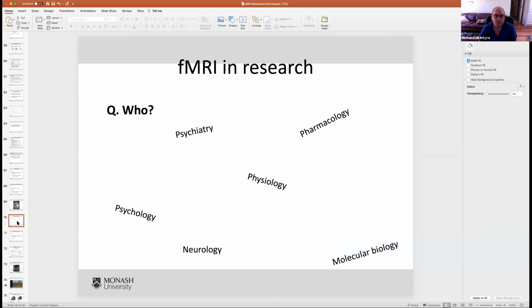Okay. And so in research, we can present all different patients with all different types of stimulus to work out what's happening with drugs in the brain, what's happening with physiology, molecular biology, psychiatry, and psychology. Okay, fMRI has a place in all of these fields.